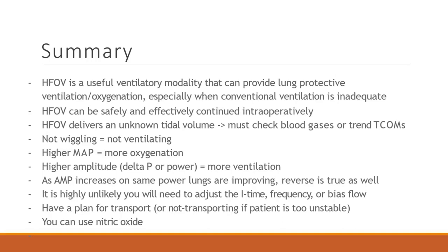And then transporting, this is where it gets crazy. Luckily, we're not that kind of hospital where we have a lot of specials that our babies need to go to. But yeah, it's very, very hard to transport on an oscillator. It really cannot be done. These oscillators do not, there's no transport version. And so that's going to be the big thing. So that's why we really want to make sure we're doing the OIs, especially initially, because if that OI is already starting to get to ECMO level, we should put them on maybe nitric and a conventional ventilator and ship, because they need to get cannulated and get on ECMO right away.